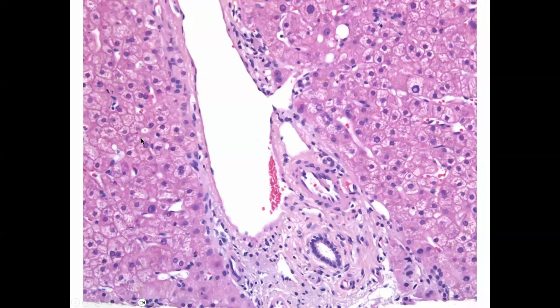The hepatocytes here, you can see, have eosinophilic, granular-looking cytoplasm, so they have a reddish-pink color, with centrally located nuclei. Here's one fat vacuole, but for the most part in this normal liver, we don't really see any fat vacuoles.